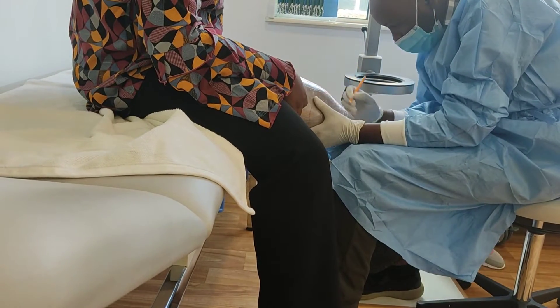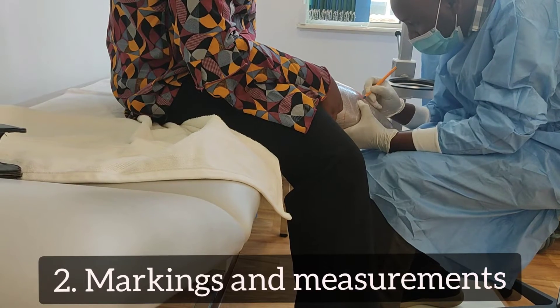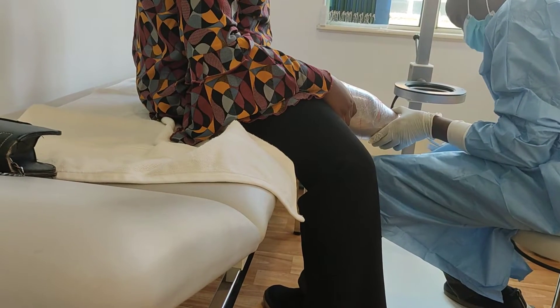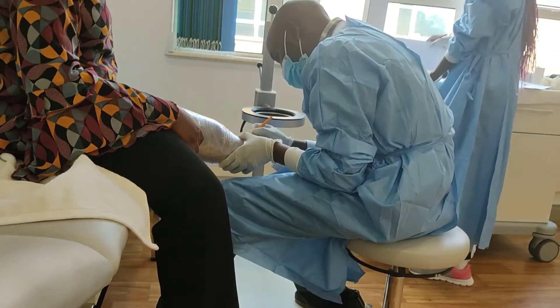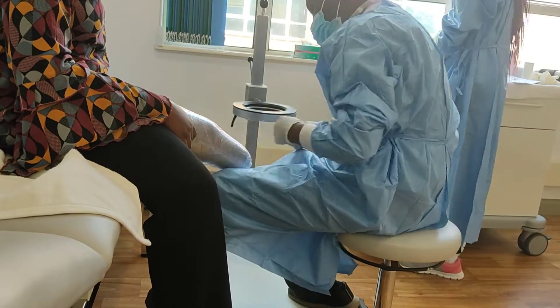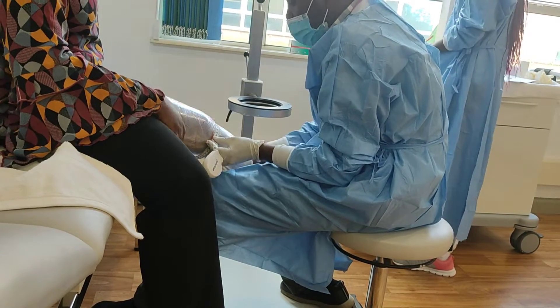After that, they're going to do some markings and they're going to take a cast of your stump. The cast is essentially to ensure that the prosthesis fits you perfectly — not too tight, not too loose, just perfect for you. That's why every prosthesis is custom-made; it has to be built from scratch, just for you.